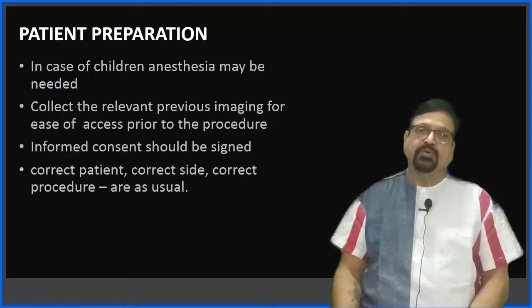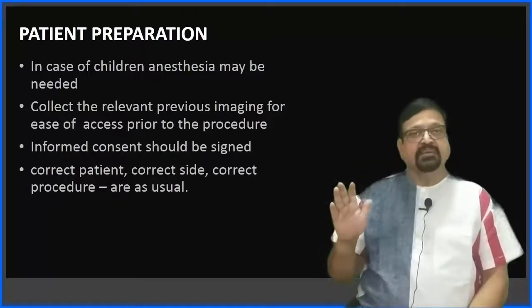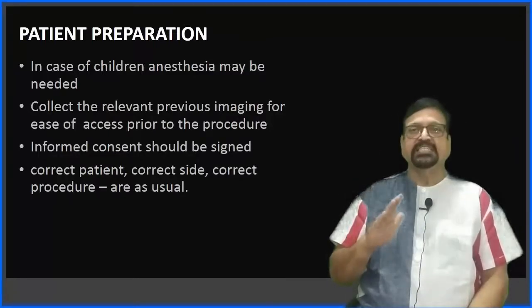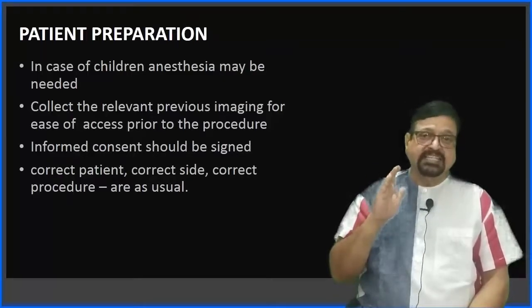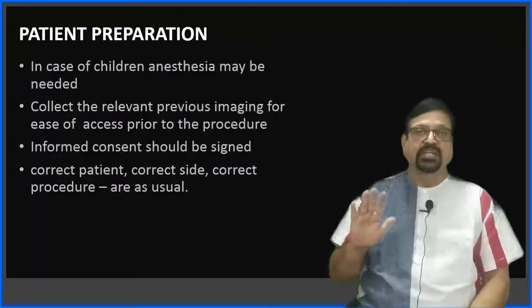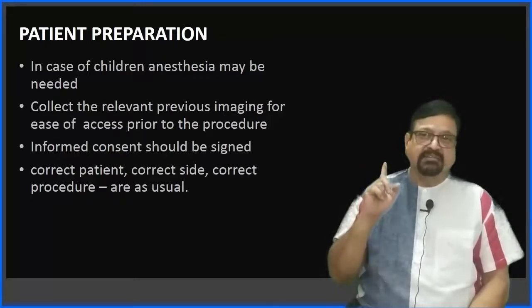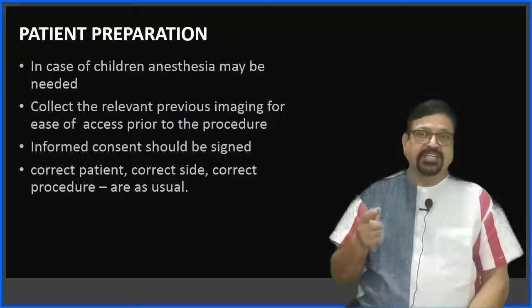That is a part of routine. I feel the procedure, though it has got no risk, it should be a routine to take a consent. So consent, written consent has to be there. But more important than consent, or equally important as the consent, is to give patient proper ideas about the risk involved. Now, of course, identification of the patient, that is correct patient's name, then correct side, correct procedure are required.